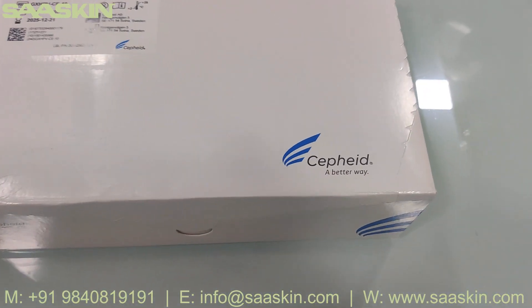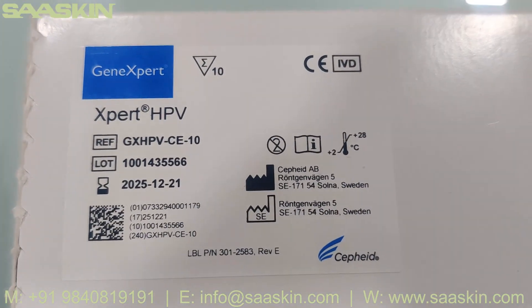Hello everybody, today we are going to see the unboxing of Cepheid GeneXpert HPV test cartridges.